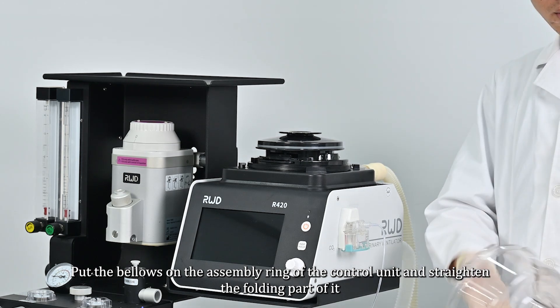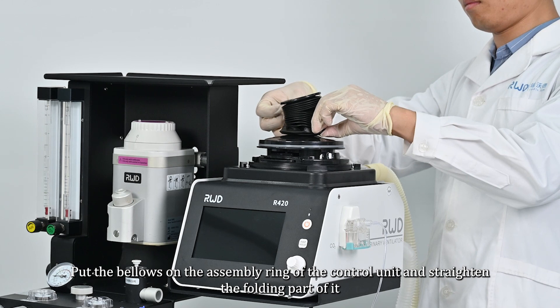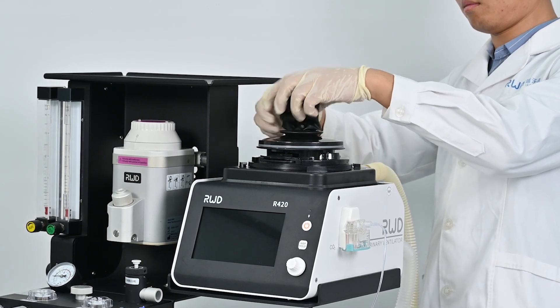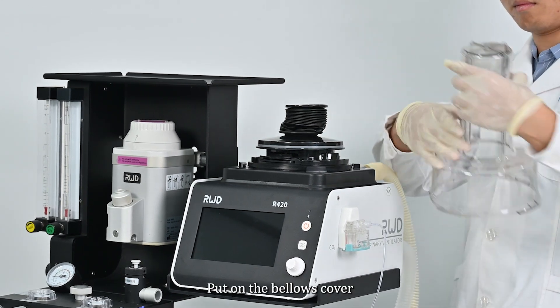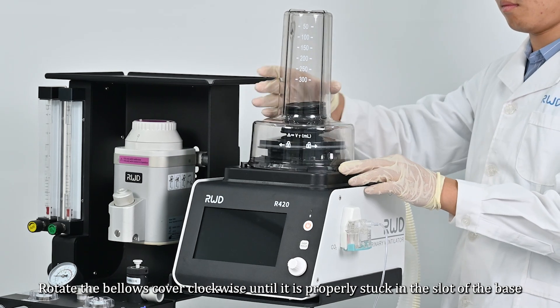Put the bellows on the assembly ring of the control unit and straighten the folding part of it. Then put on the bellows cover and rotate the bellows cover clockwise until it is properly stuck in the slot of the base.